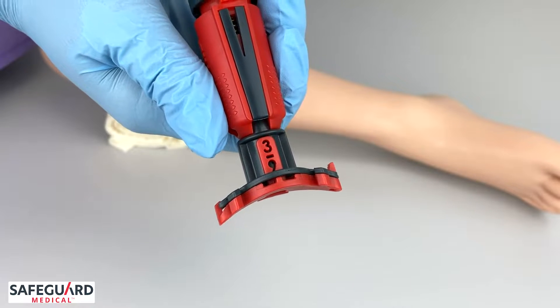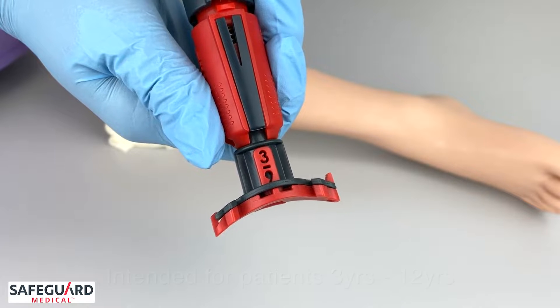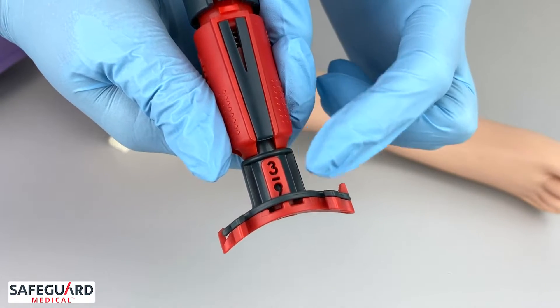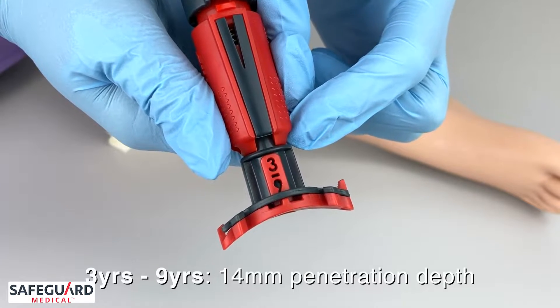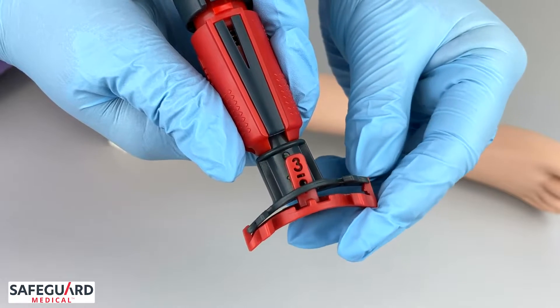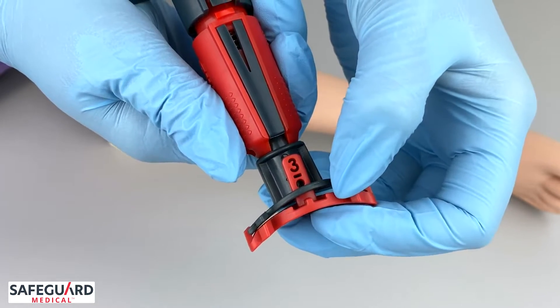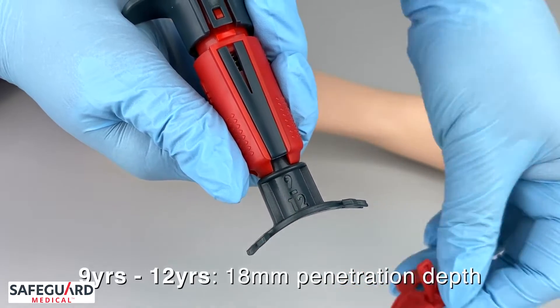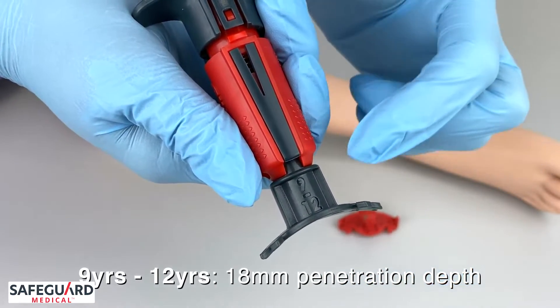The NIO pediatric intraosseous device is intended for patients ages 3 to 12 years of age. Ages 3 to 9 years has a set penetration depth of 14 millimeters. Once you remove the red spacer, the penetration depth increases to 18 millimeters, intended for patients ages 9 to 12 years of age.